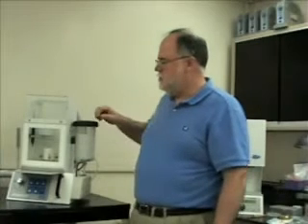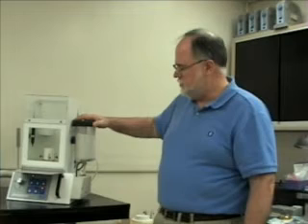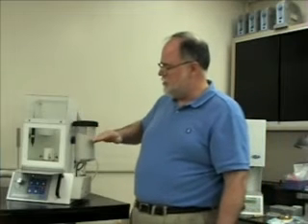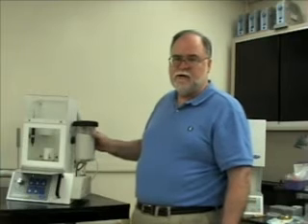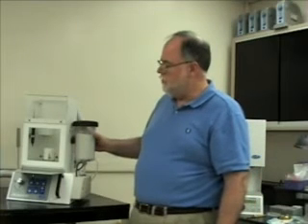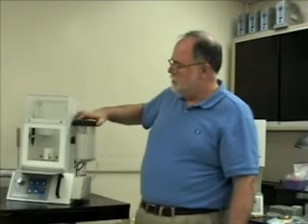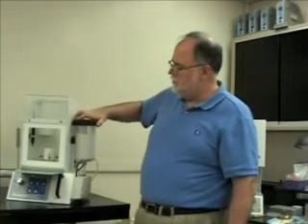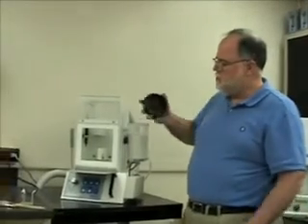Okay, next we're going to discuss the routine maintenance of the excavator unit. We just talked about the way the air pressurizes and pushes down on the beads. So this plastic jar is pressurized during normal operation. In order to make that happen, there is in the lid a seal which should be at least inspected, if not removed and cleaned on a weekly basis.